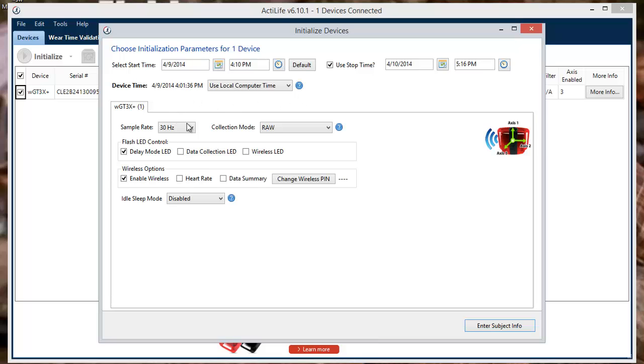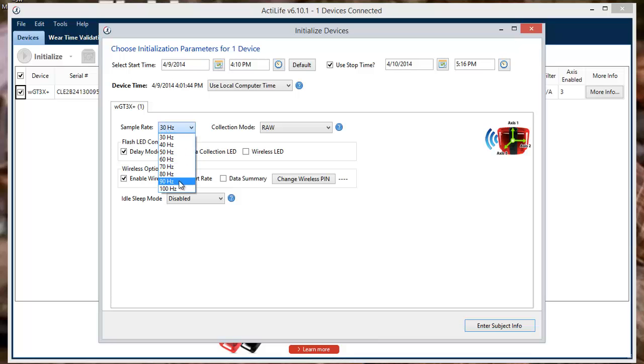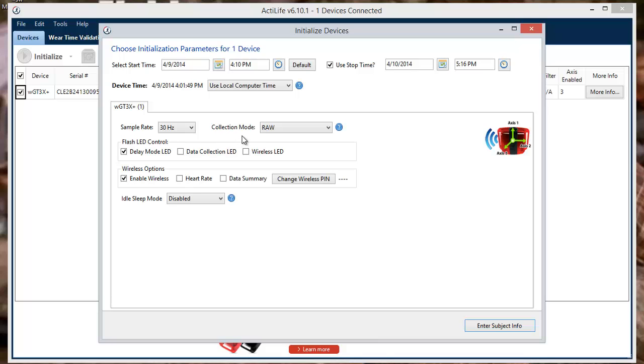With the dates and time set, we can now adjust the modes of the device. The sample rate will allow the device to collect physical activity samples from 30 to 100 Hz, or 30 to 100 samples per second. The collection mode will remain on RAW, but this can also be altered.